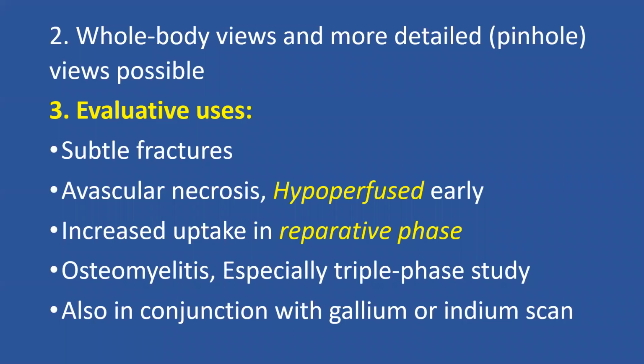Whole body views give us extent, and you can have pinhole views. It is good in detecting subtle fractures. In avascular necrosis, it tells us whether it exists by being hypoperfused to the area. It has an increased uptake in the reparative phase of avascular necrosis.